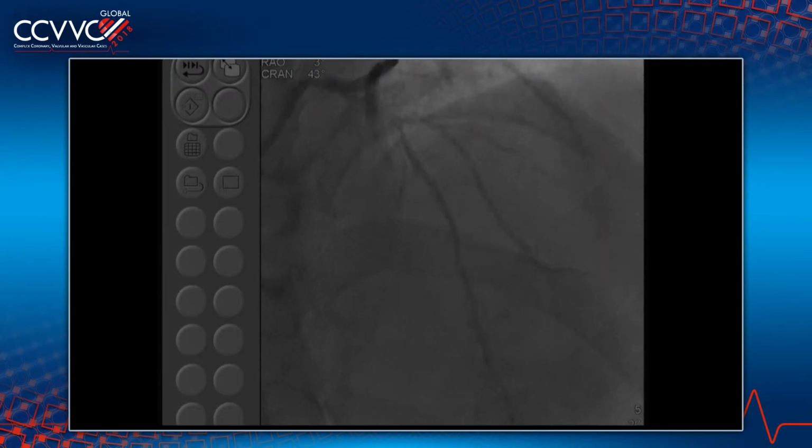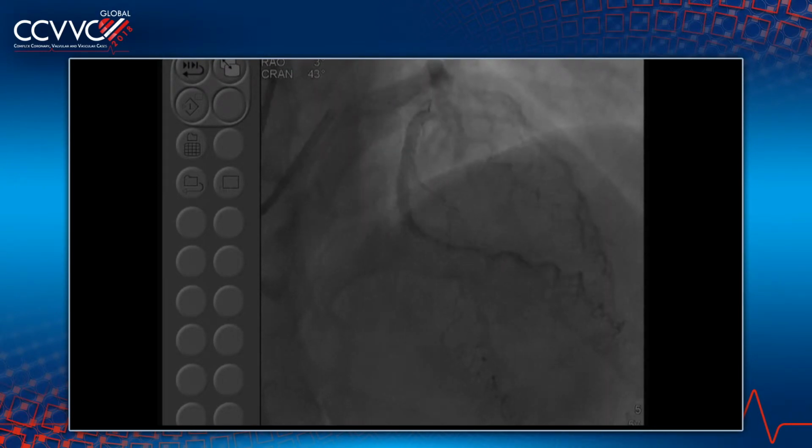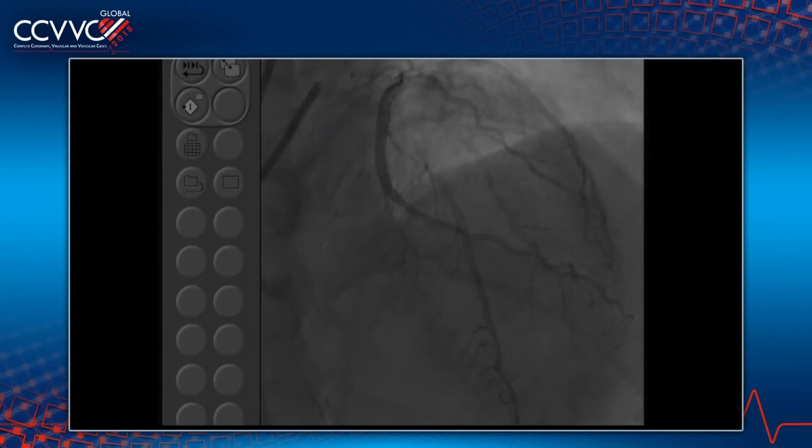Dr. Barman does a lot of our radials. Everyone does radial, but I think he's really a proponent of radial. I want to know, are you using left or right radial, and when are you choosing what? Tell us how. Dr. Barman: I think our default is right radial unless the patient is older age.